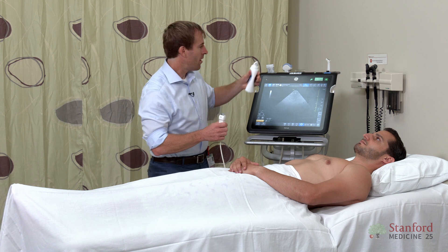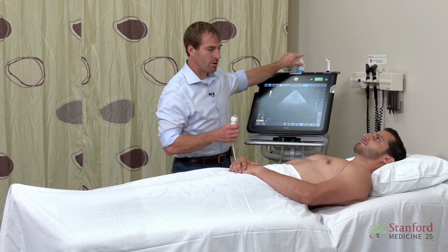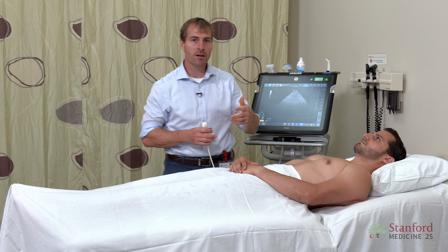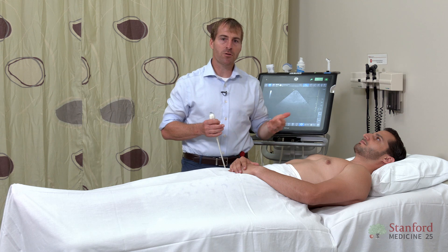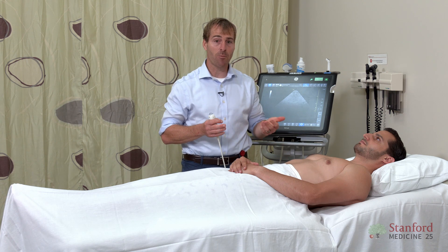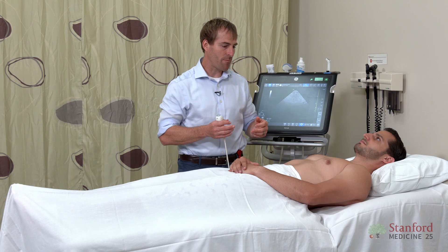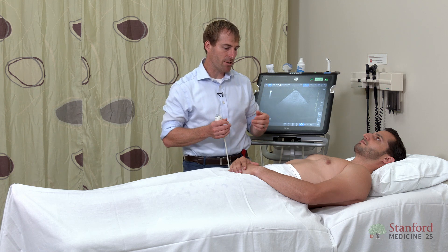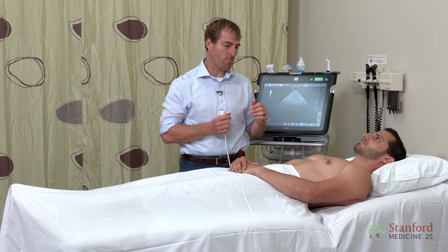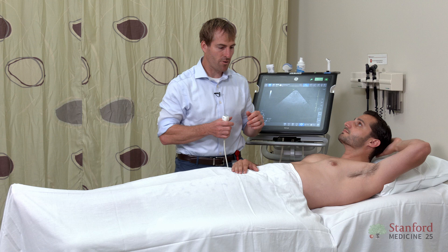Today we have a healthy patient who has no problem moving, but if you're working with older or sicker patients, you may actually need to help them move in bed. I'm going to have my patient go ahead and take their left arm and put it behind their head. Perfect.